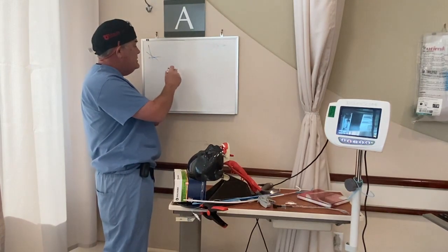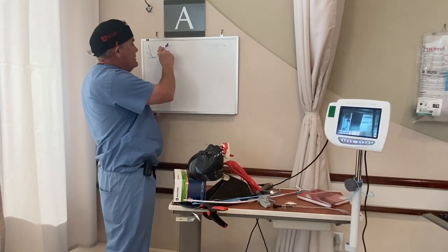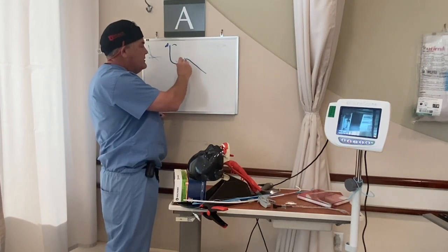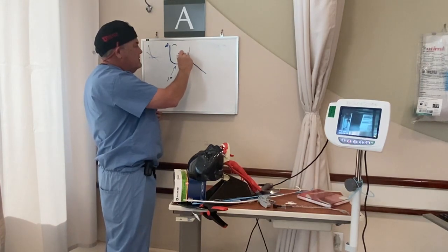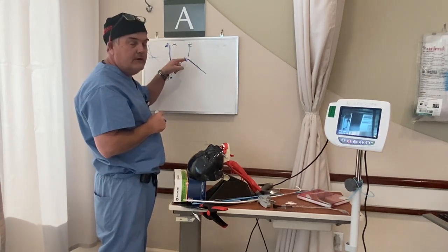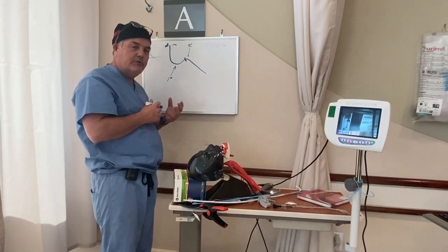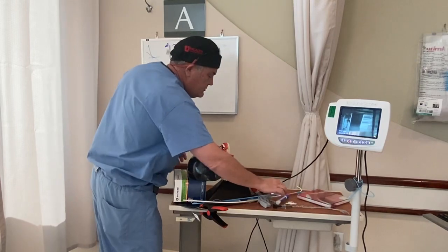Ken Greenland, an anesthesiologist, published a different theory of intubation anatomy in 2011. He said the natural airway has two curves — it's serpentine geometry. The vocal cords are at the inflection point between a primary curve and a secondary curve, and those curves are in opposite directions: anterior then posterior orientation. This model helps explain both direct laryngoscopy and video laryngoscopy intubations.